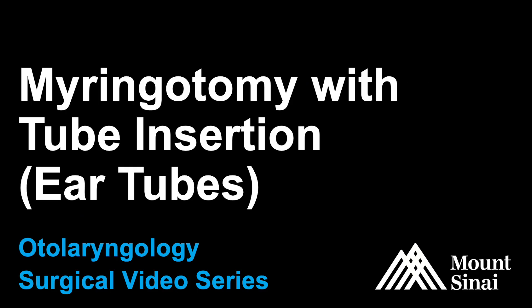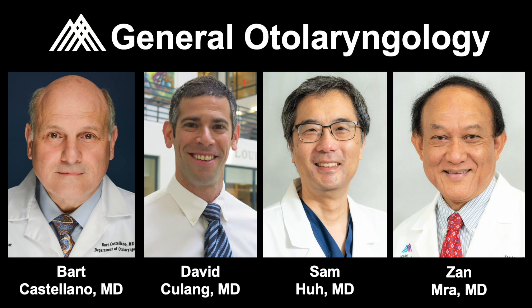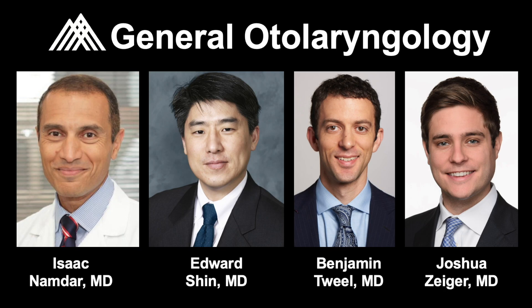The Mount Sinai Otolaryngology Surgical Video Series presents Myringotomy with Tube Insertion, often referred to as ear tubes. This procedure is performed by multiple members of our pediatric and adult general otolaryngology as well as neurotology divisions.